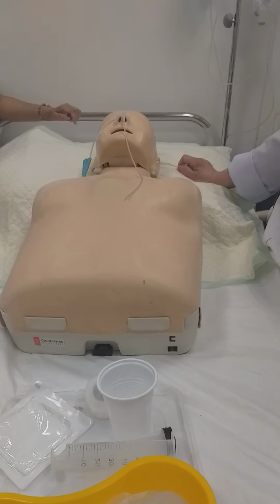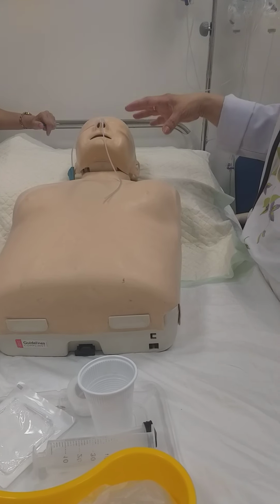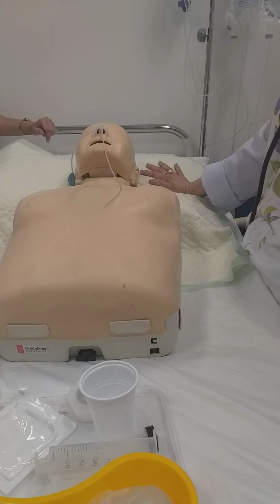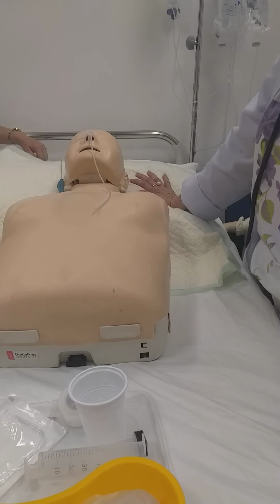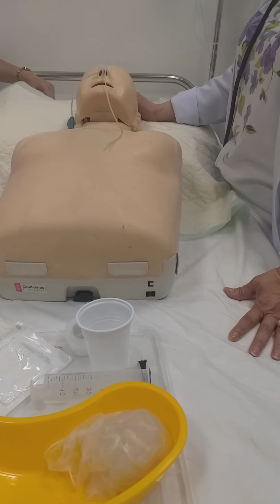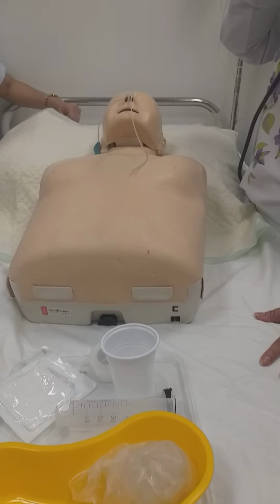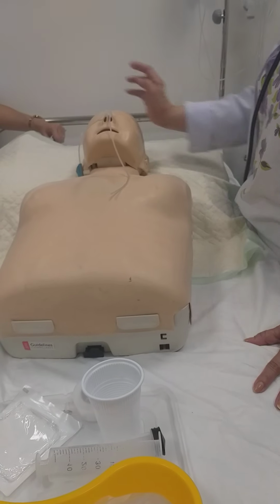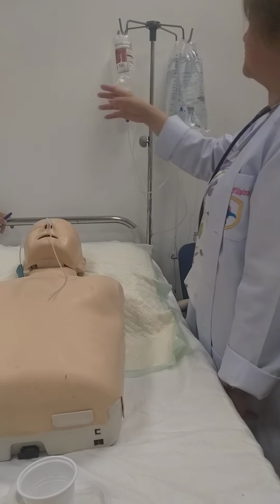Last, document everything. Date, the time, what you did, how much feeding you gave, and how much water you gave, and if the patient tolerated, vomited, all of those. Okay? Now, done. Next feeding, we will give by the tube.